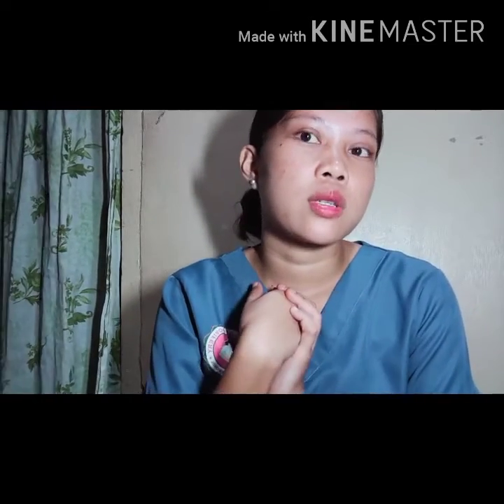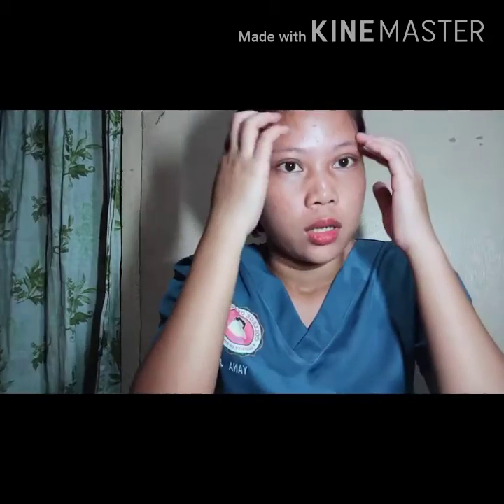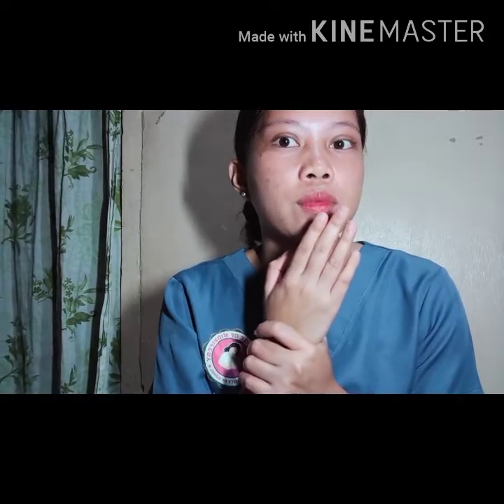So if i-dress nimo or i-label nimo ang katong imong gitawran, label should have done on which date rather on which administration set must be changed. So like imo i-label dito is kanus ani mo gibutang, kanus ka nagtaod og IV, kanus unsang orasa of type and length of catheter mo to imo i-label sa puncture site.